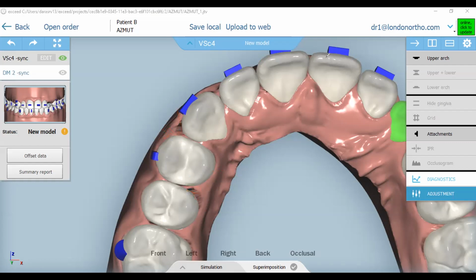I don't have a place, or I don't have enough space, to go in there with the aligner and push that tooth. That is why I use an attachment, because I want to generate that surface. There are even doctors who, and I don't do this anymore, I did this when I was starting, like to place an attachment on the buccal and one attachment on the lingual. So this will be up to you, but this is something that can also be done.